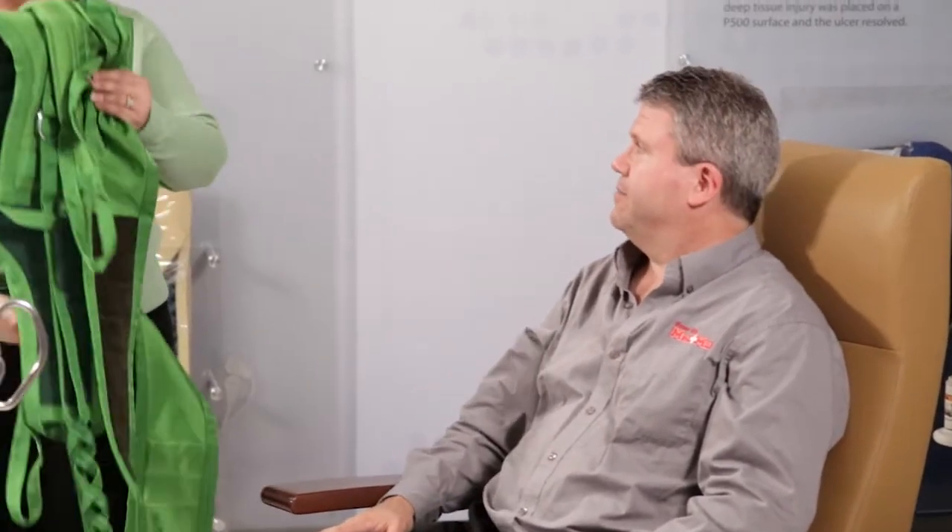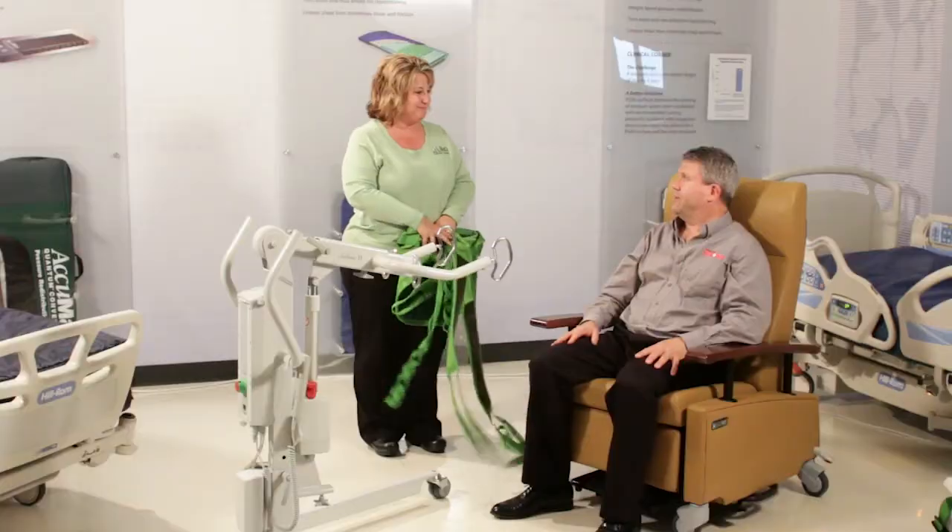So that's the Sabina 2, using it as a sit to sit. It was very comfortable. Thank you, April.